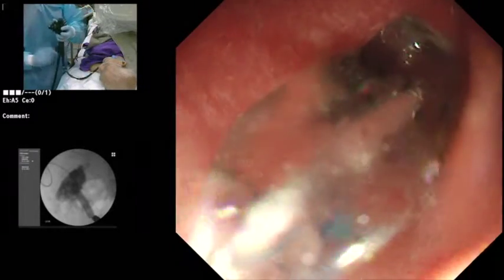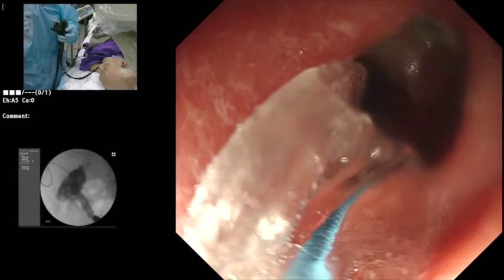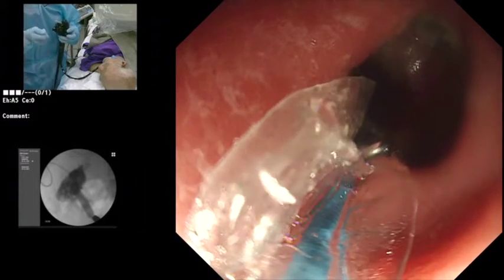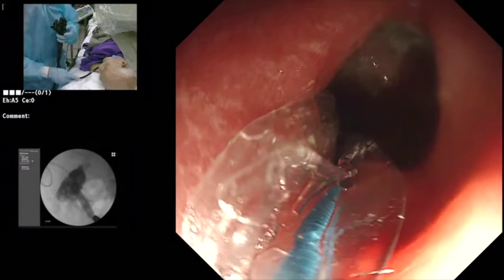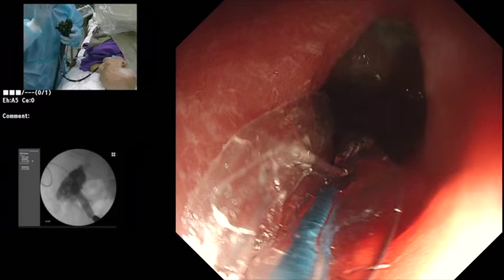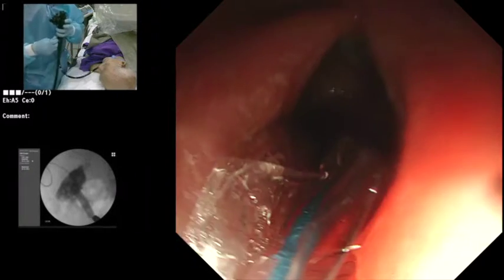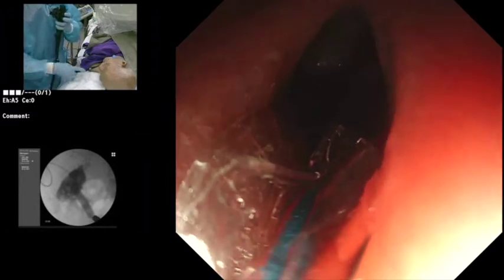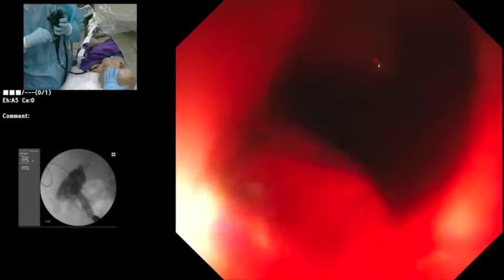Now, back in the day when we used to do tract dilation with the balloon and then do necrosectomy, as we deflated, we would pull the balloon into the working channel of the endoscope, and that would help us get in. There's no need for that now because we have a port. So all I'm going to do now is just very gently, because I don't want to risk that if maybe the end of the balloon has caught the stent, that I pull the stent out.